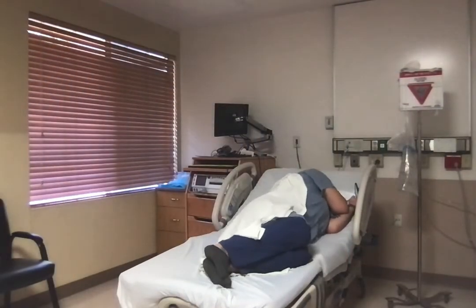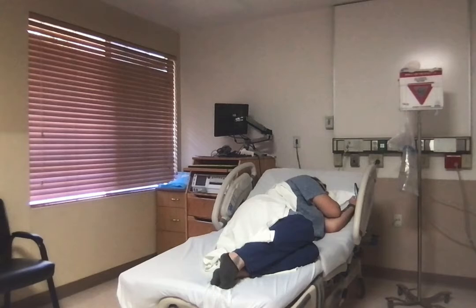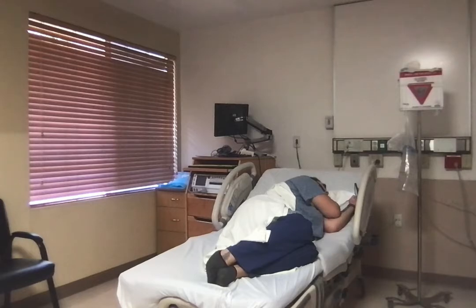At the nurse's station, the nurse, Lake, observes fetal heart rate improvement to baseline and regain moderate variability within 10 minutes and remain absent of decelerations for another 20. Nurse Lake returns to the mother's room after performing hand hygiene.